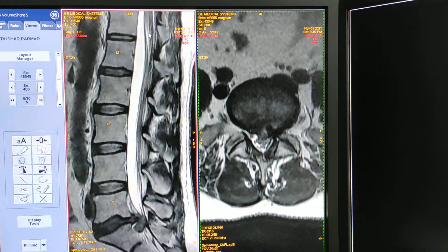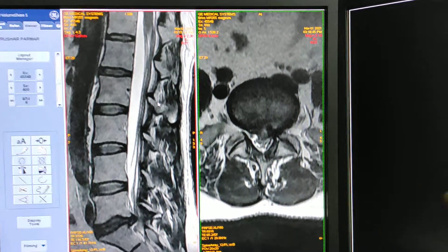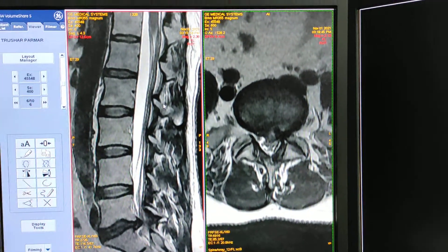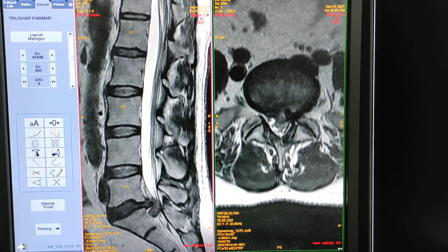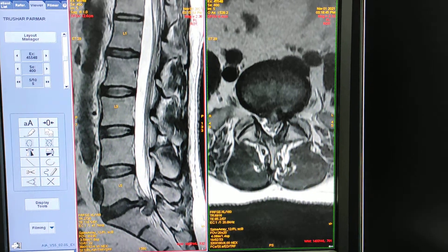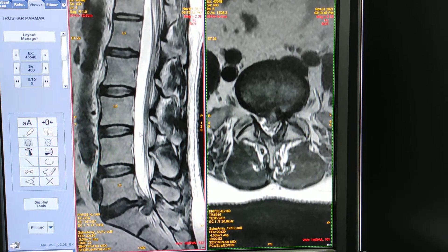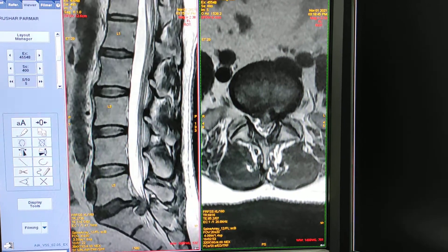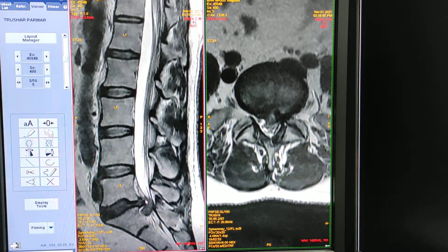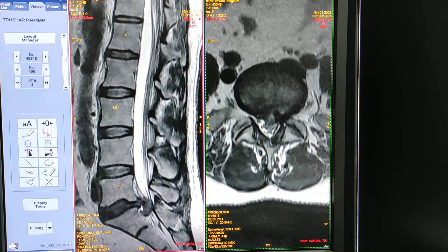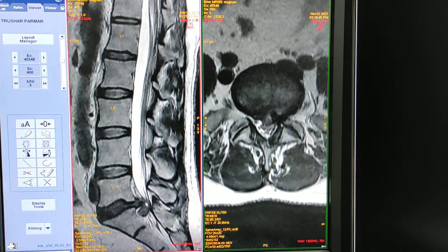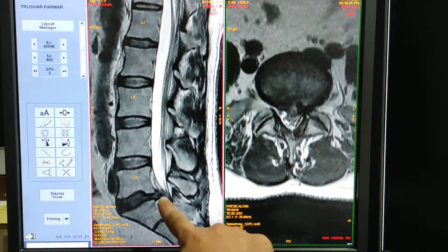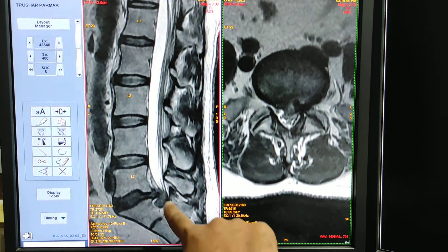The spinal cord ends at D12-L1. Here, these are all the nerve roots. This white area is the CSF. Here you can see a large massive disc herniation from the L5-S1 area — this is a large disc herniation.